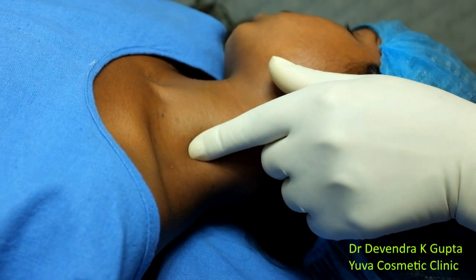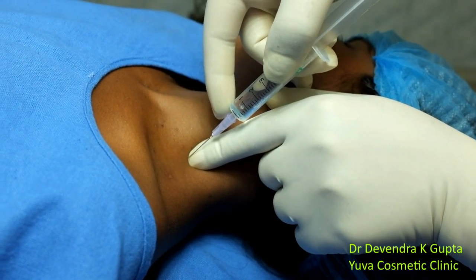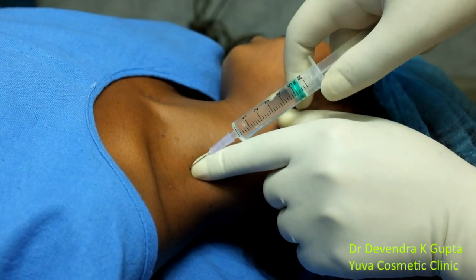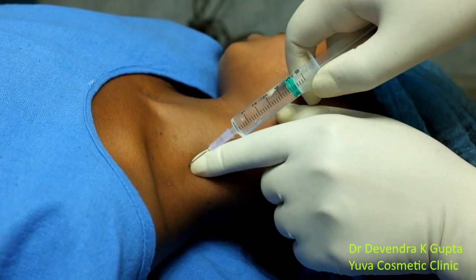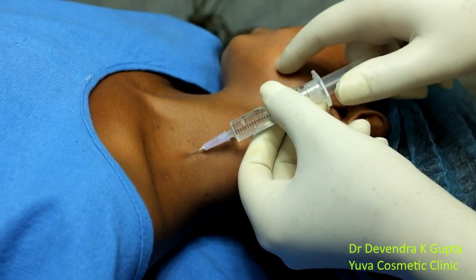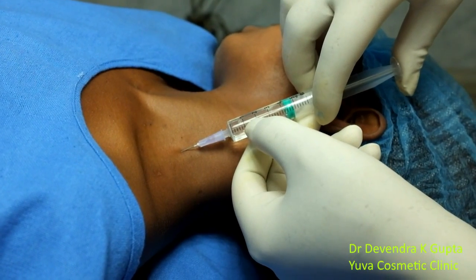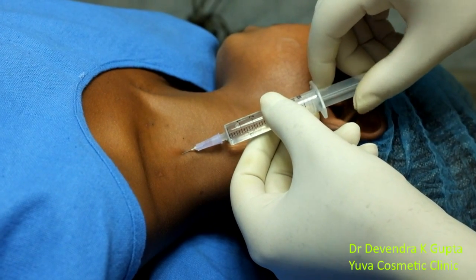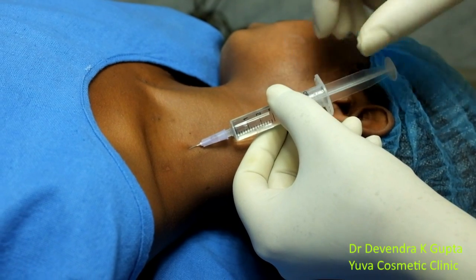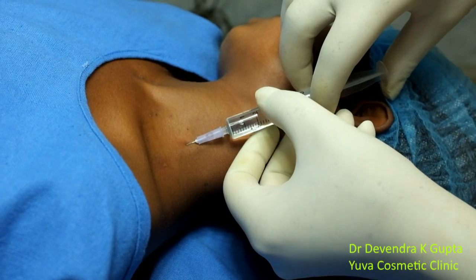I have punctured the skin. Inject here after aspiration. Since this is a child and I am giving this block while she is quite awake, aspirate and do not inject before aspiration. Go slow from the upper interscalene space towards the lower interscalene space.